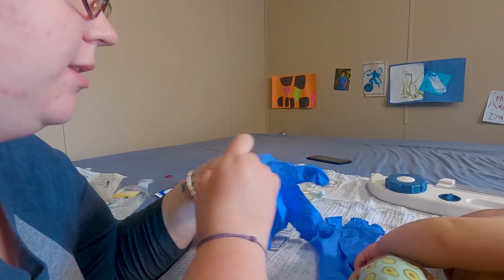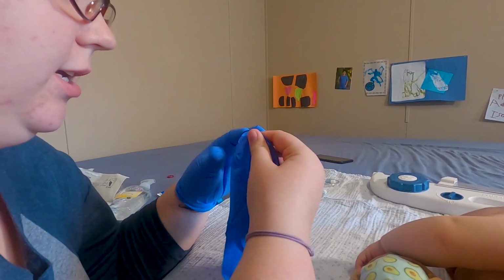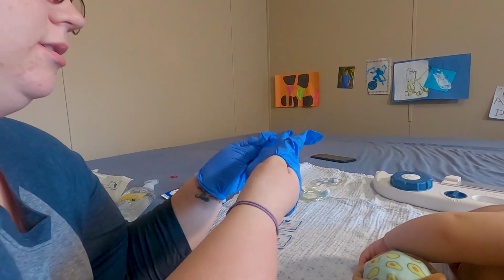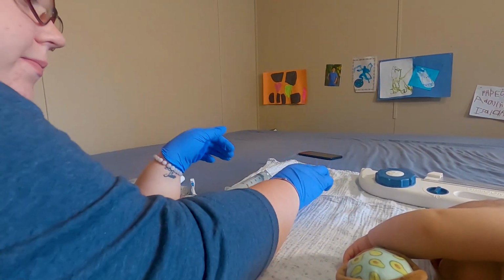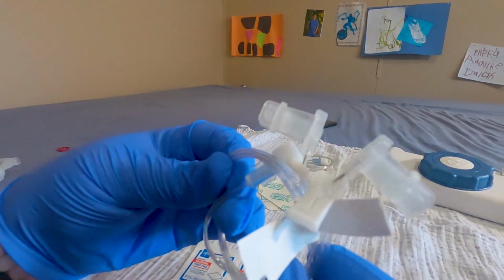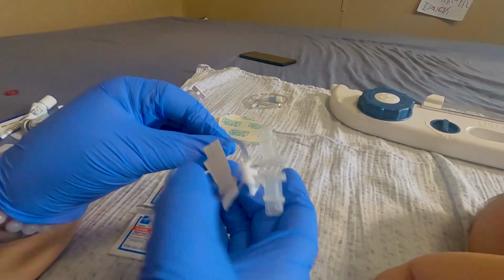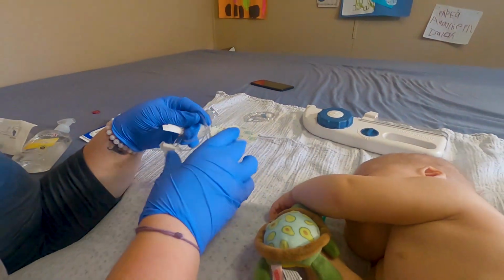Now I'm about to start messing with the needle part. And again, I'm going to say my hands were clean. They were washed. Okay, so when it comes in, this is what it looks like. This is 2 needles. So we're just going to untangle it.